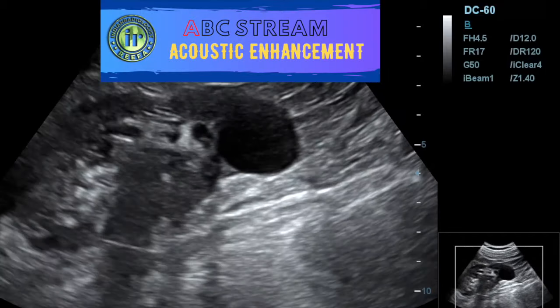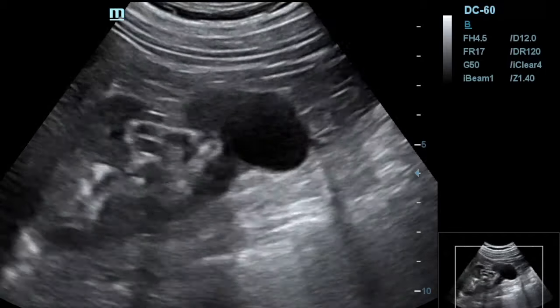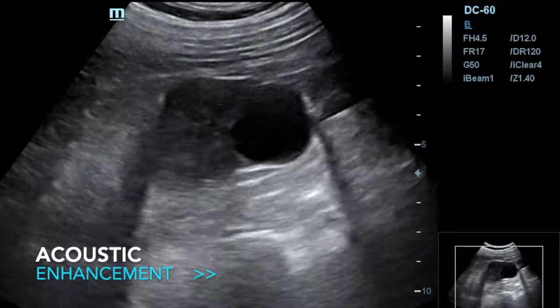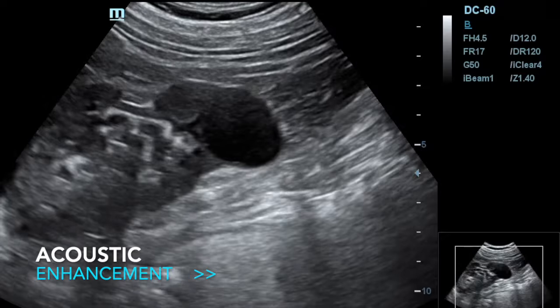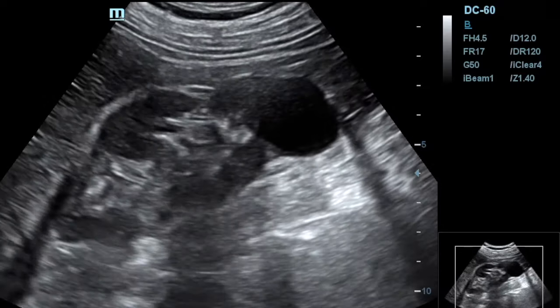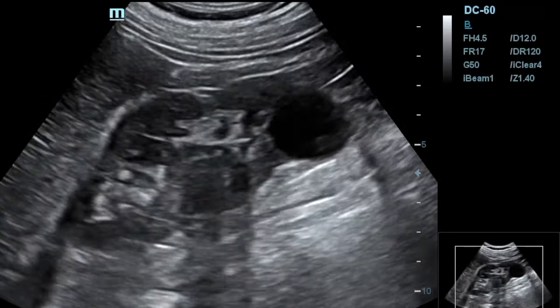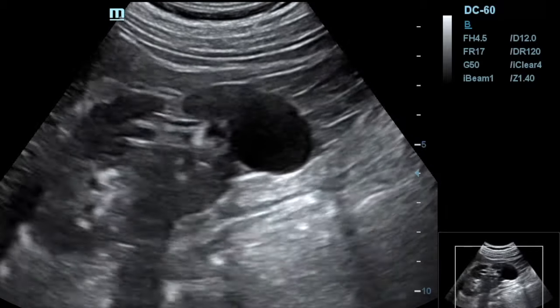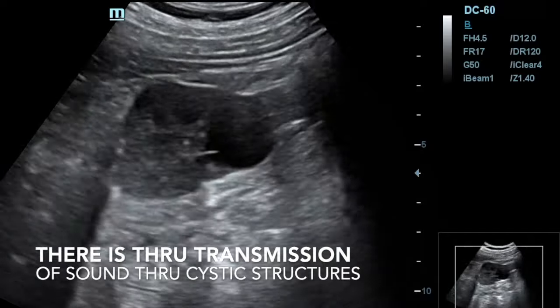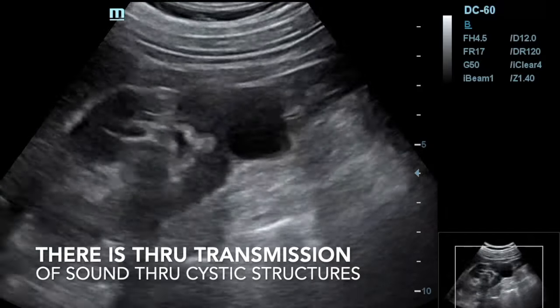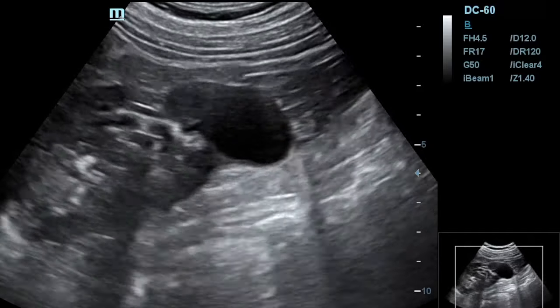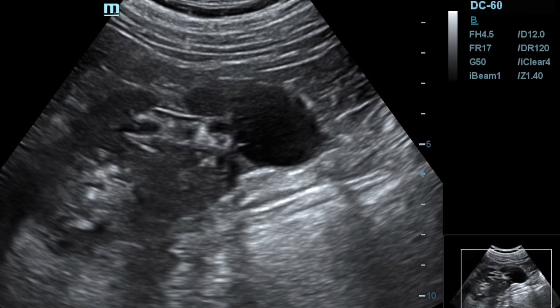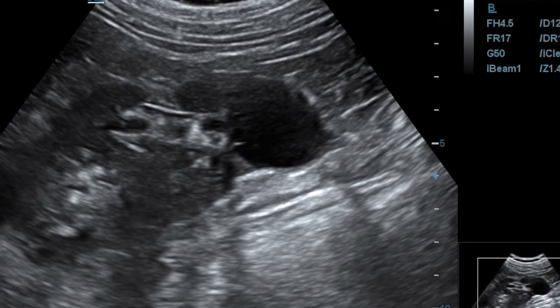The exact opposite of acoustic shadowing is acoustic enhancement, seen as a localized area of increased echo amplitude behind an area of low attenuation. It is seen behind fluid-filled structures such as the urinary bladder, a cyst, or the gallbladder. This occurs because sound travels very easily through fluid-filled structures, creating very low attenuation and allowing the beam to pass fast through that area, generating a raised signal distal to that structure.